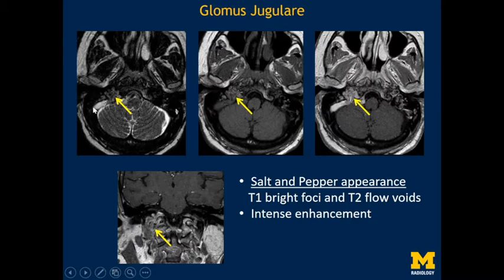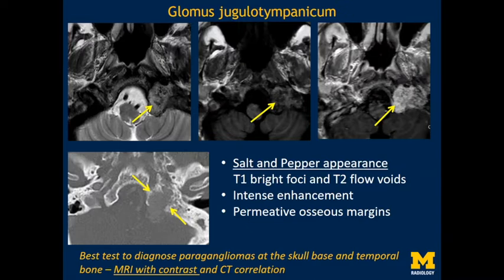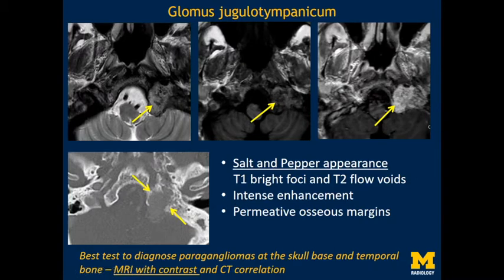Another patient with left-sided pulsatile tinnitus shows the salt-and-pepper appearance again with a hyper-enhancing lesion. A correlative CT shows a clear permeative osseous margin. The best test to diagnose a paraganglioma at the skull base or temporal bone is a combination of both MRI with contrast and CT correlation. MRI classically shows the salt-and-pepper appearance, while the CT permeative margins help distinguish this from schwannoma or meningioma. Hypervascular metastases — for example from renal cell carcinoma — can also cause pulsatile tinnitus.